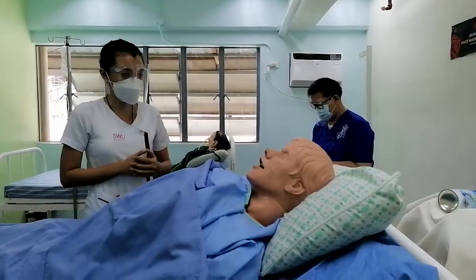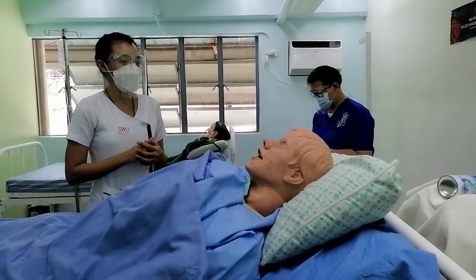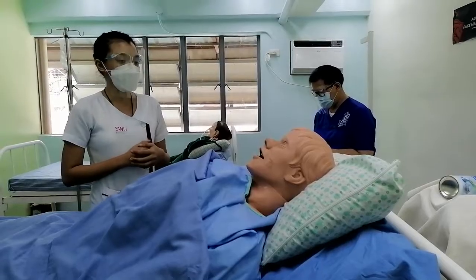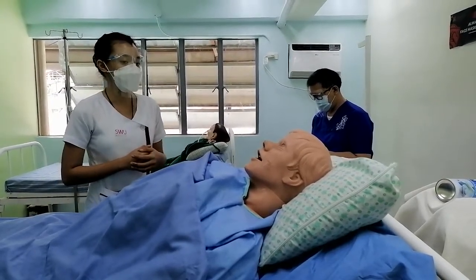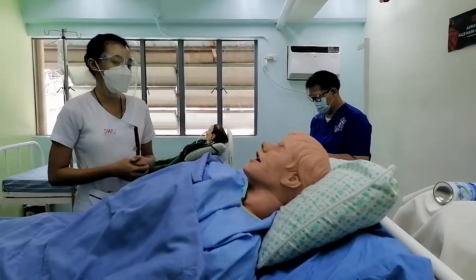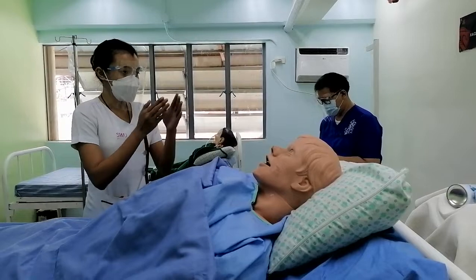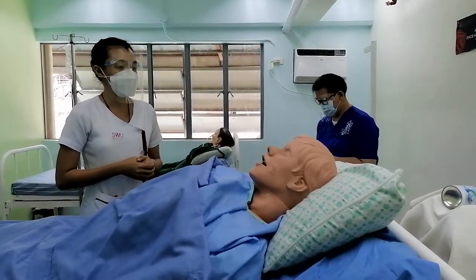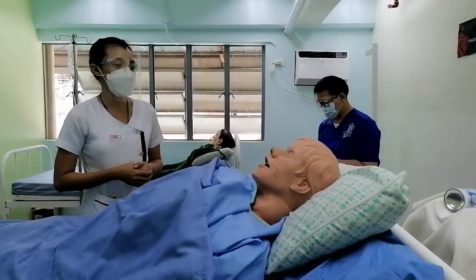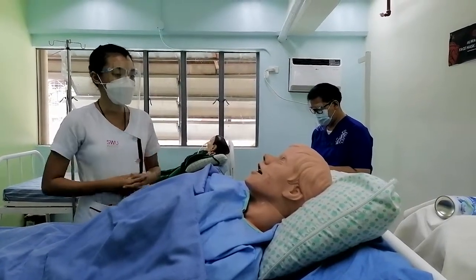After that, we will assess the patient's medical history. The purpose of assessing medical history is to determine what underlying condition can compromise the bleeding. So we will assess if the patient has a history of unusual bleeding from the nostrils, or if the patient has experienced some surgery in the nostrils.